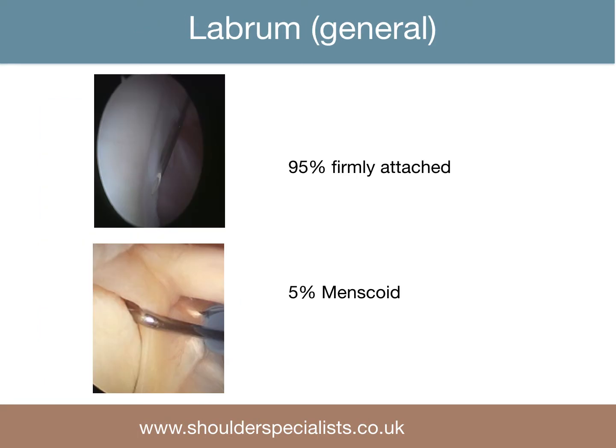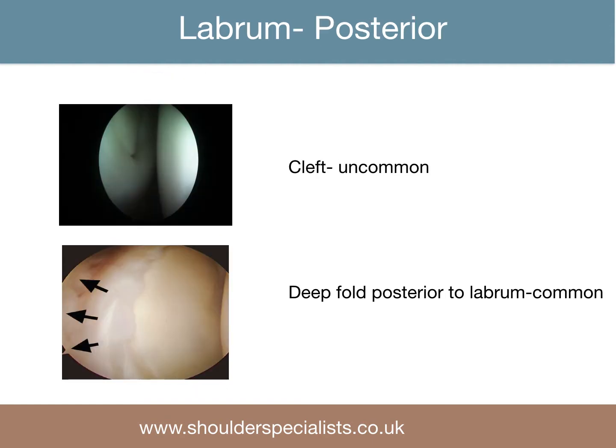The labrum is generally firmly attached in 95% of cases, and meniscoid in 5% of patients. Rarely there is a cleft seen between the glenoid and attachment of the posterior labrum, as seen in this view of the posterior and inferior labrum, but it is common to see a deep capsular fold adjacent to the posterior labrum.